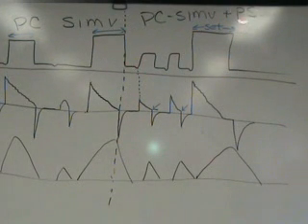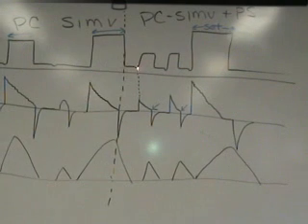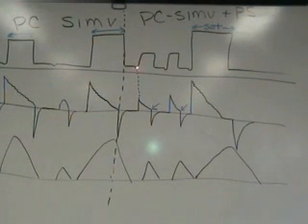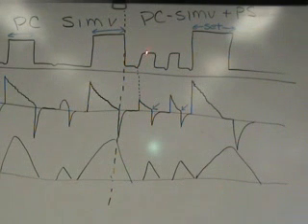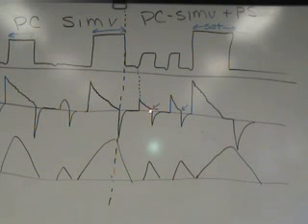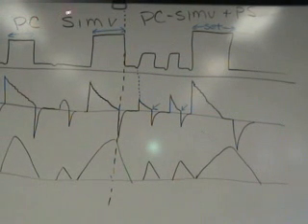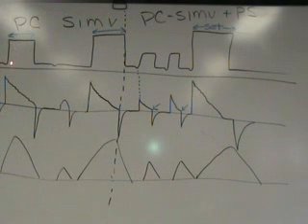Here, since we've added pressure support, when the patient triggers the breath, remember, pressure support is a pressure boost. So it brings that breath to a preset pressure level until the flow rate decelerates to a certain point, and the flow rate cycles that breath off. Volume delivery will vary because this is pressure support. So if I were to classify pressure-controlled SIMV, I would say the SIMV is either machine or patient-triggered, pressure-limited, time-cycled ventilation.